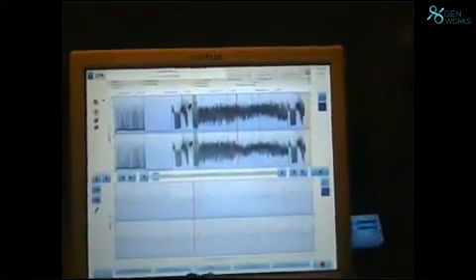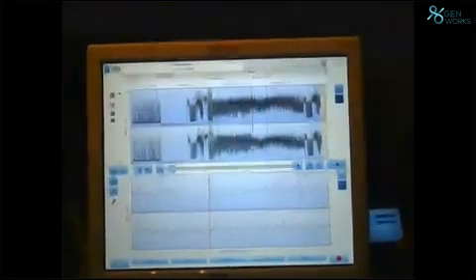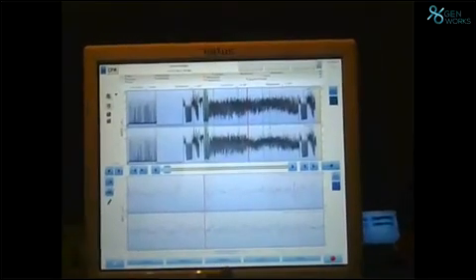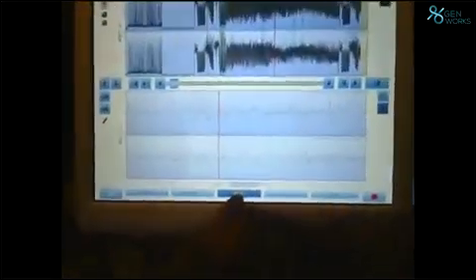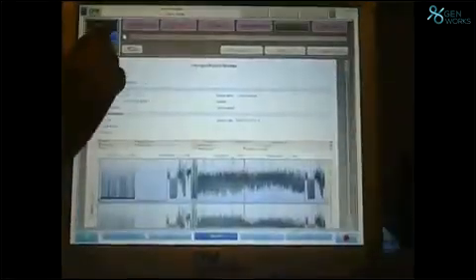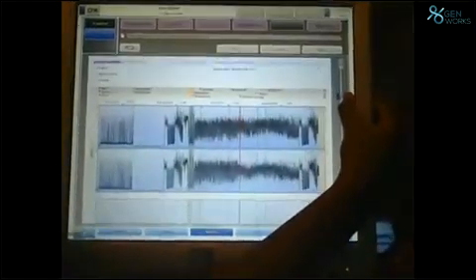Number second, Jafar was telling, very good, sir, everything is entered. How can I give the document to the patients? Because I have to document. Our sister has written double things. So I will go to the snapshots, go to the reports. Can you go to the reports, sir? See, this is reports. Once you go to the report, whatever window it was showing will come like this. Can you come down slowly?